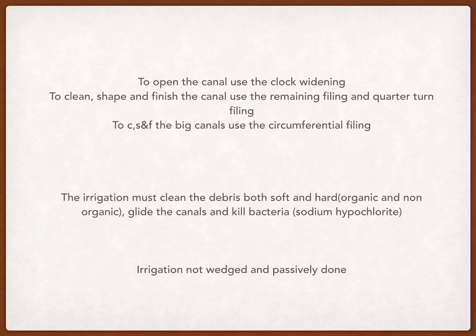Finally, the irrigation should be done with an irrigation needle that should not be wedged, and the syringe of that needle should be pushed passively, not forcefully.